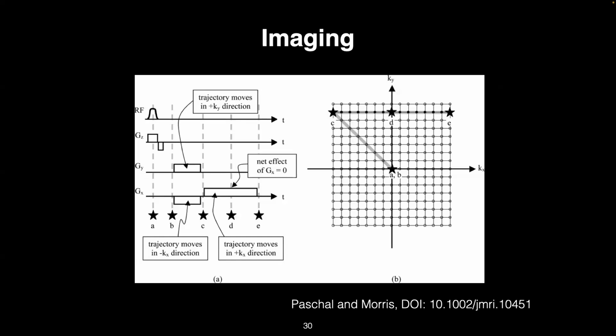So one additional concept tied to this is how this is encoded. This is a schematic of what the gradients in an MR system are doing for a very basic type of imaging sequence. This is probably one of the more basic imaging sequences. There are a few simpler ones, but if you want to get a simple two-dimensional image, this is about as basic as you can get.